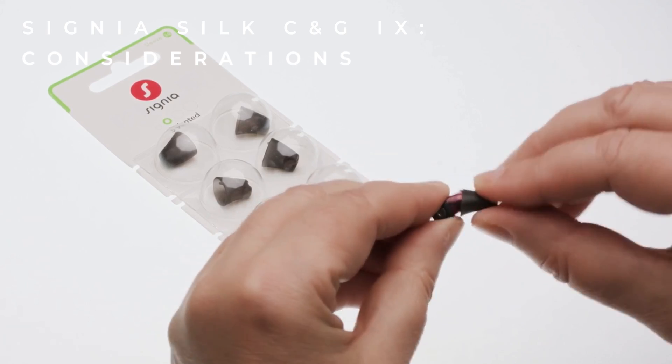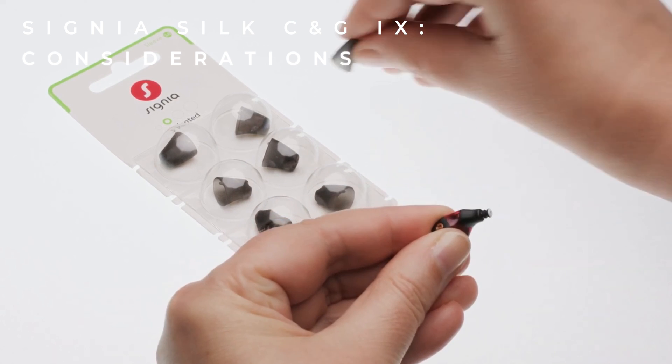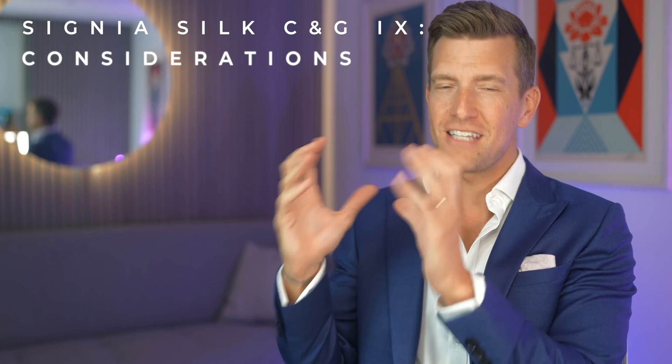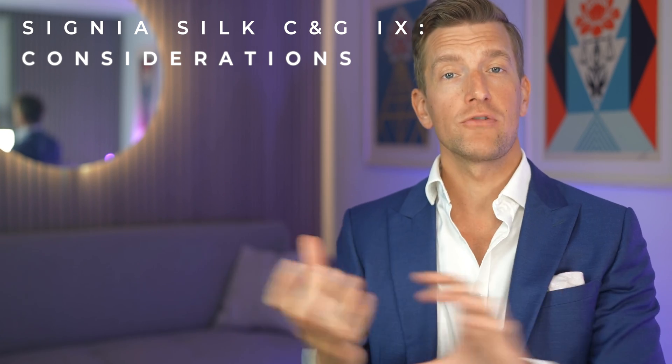The third thing to consider is that whilst it is a positive to be able to customise these hearing aids by changing the tips rather than going through the entire process of having an impression taken as you would with conventional CIC hearing aids, this does mean in reality that they don't fit quite as well as a custom-made set. There are instances where audiologists may want things made in a very specific way — for example, with venting to allow your ears to breathe and prevent the occlusion effect — and we don't have that same degree of control as with a hearing aid specifically tailored to your ear canals.